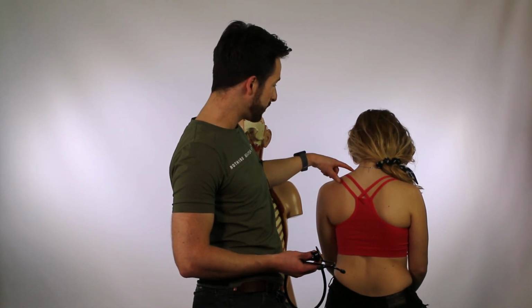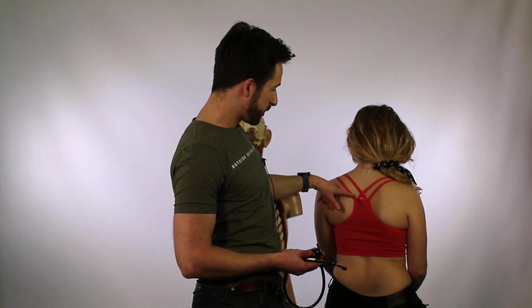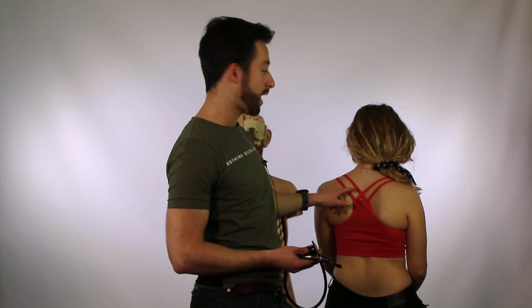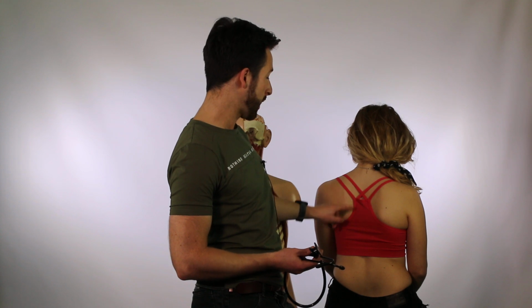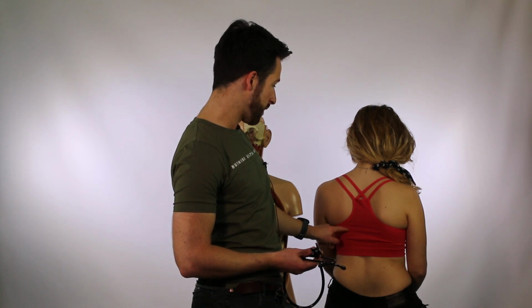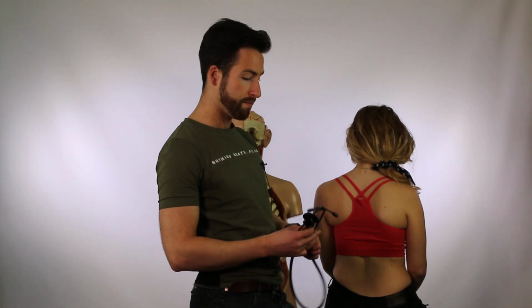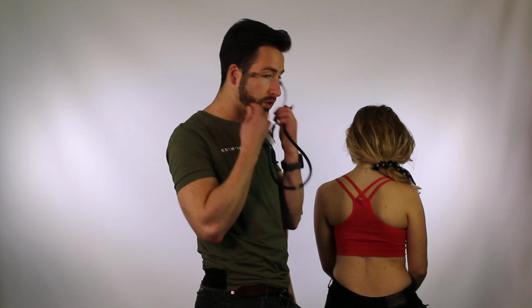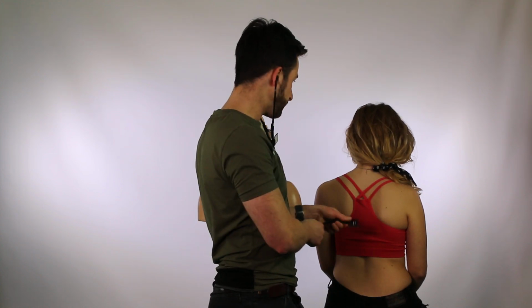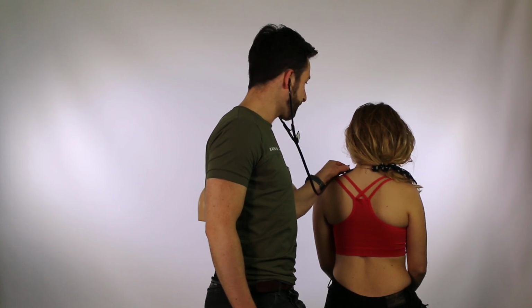Then we're going to move down to T1. And then we're going to auscultate in between the midline of the scapula and the spine. And then we're going to move down to the lower part of the scapula and then to the side. So again, I'm just going to quickly show you. So Hannah, can you breathe in and out?